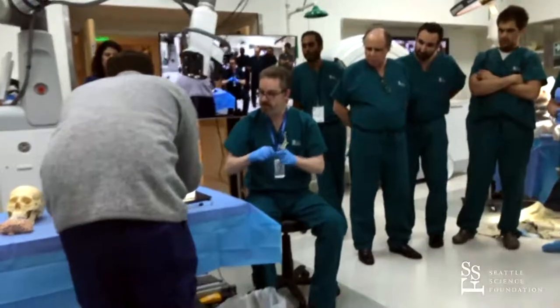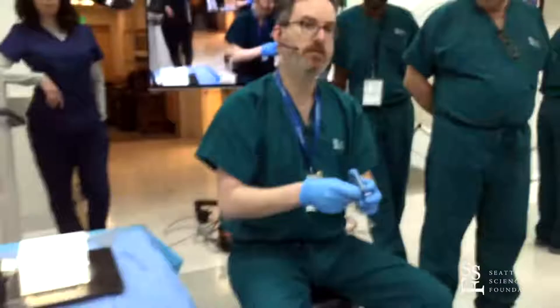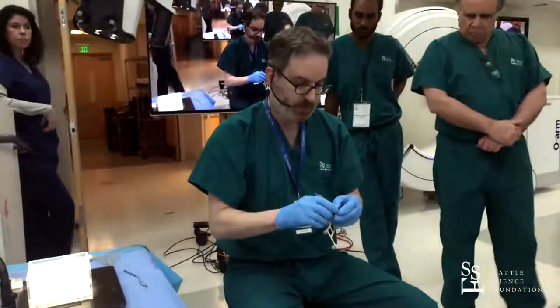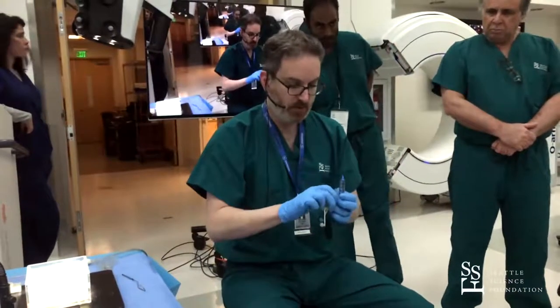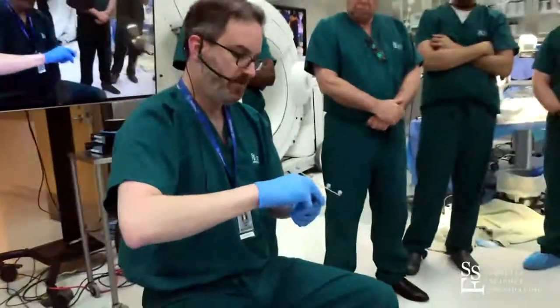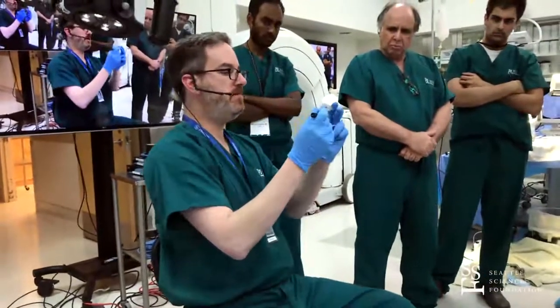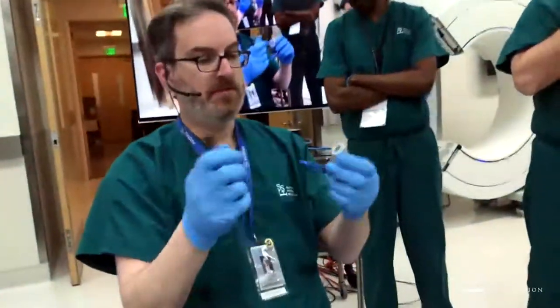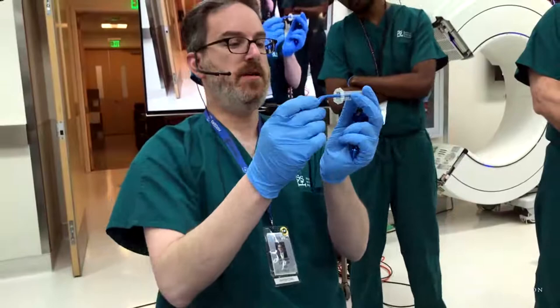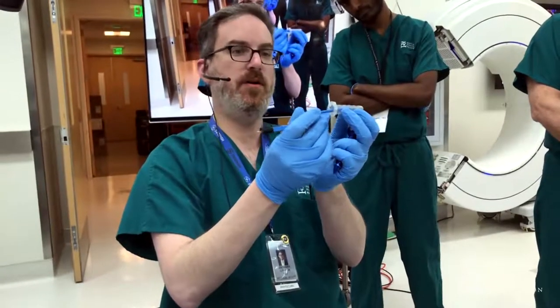There are a couple of things to talk about the general setup. This is a port that's going to be used for a trans-sulcal, trans-cortical approach to a subcortical target that can either be intraparenchymal or intraventricular. The outer diameter of the typical working channel on these is 13.5 millimeters, so it's not a ton of room.